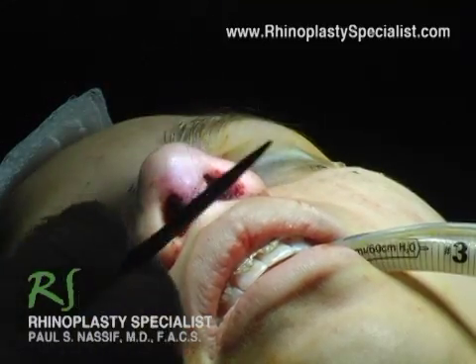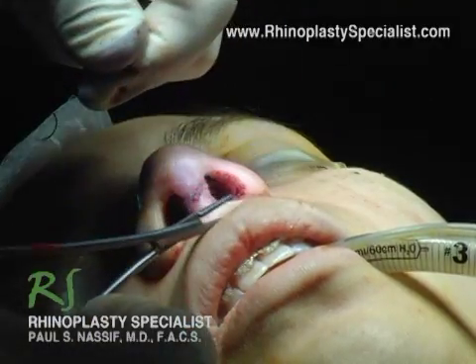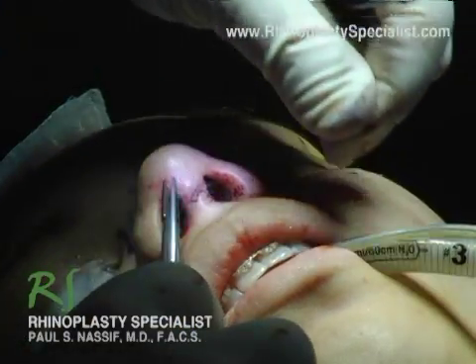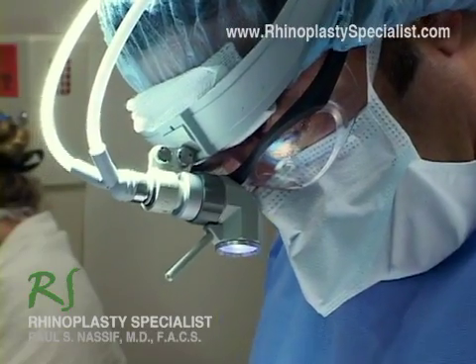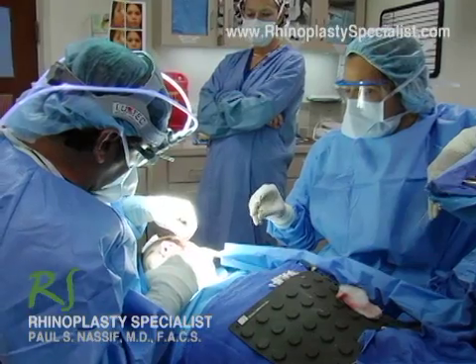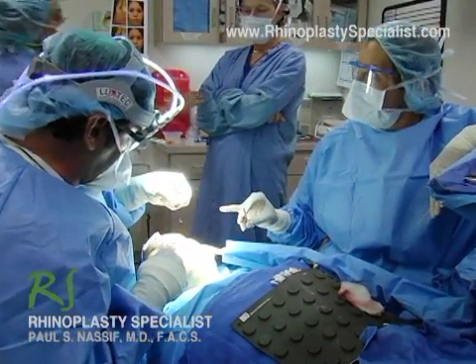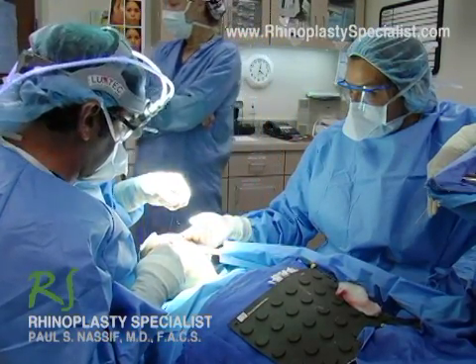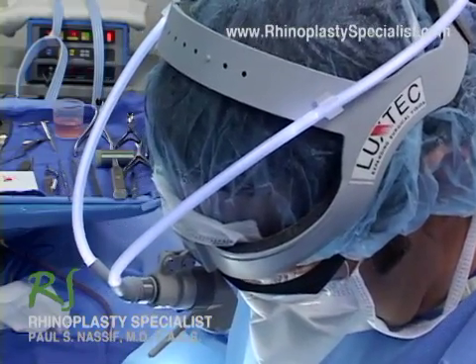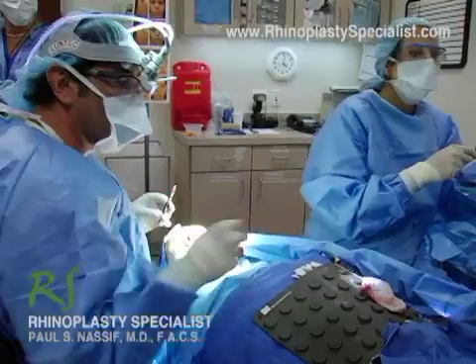Following surgery, after the stitches are removed, I'll start the patient on scar gel — I usually start this about two weeks after surgery. Scar gel is a silicone-based product which helps decrease any scar formation. In addition, we can treat the scar with the pulse dye laser, which is an in-office procedure that will help decrease some of the redness of the scar.